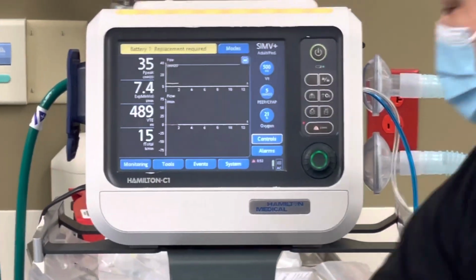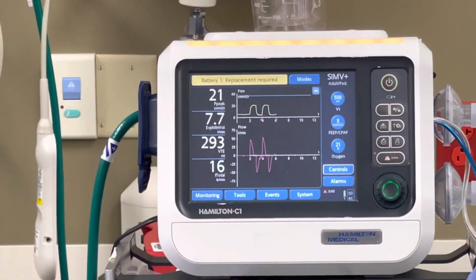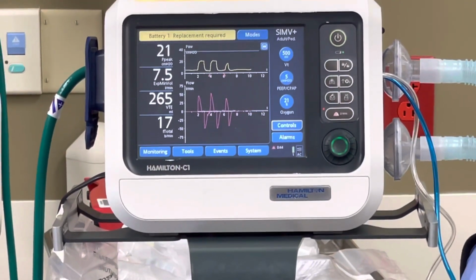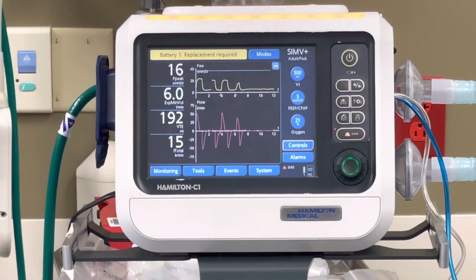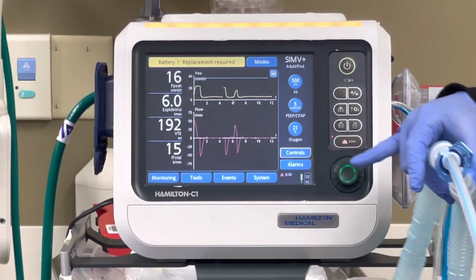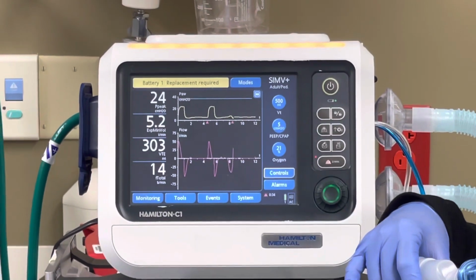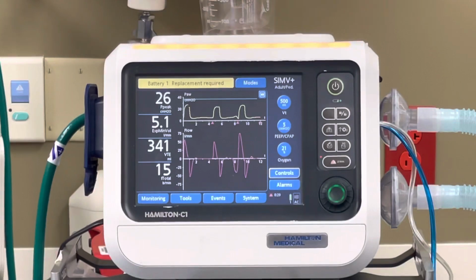The only difference here is, like I said, every breath that's the normal breath that's supposed to be delivered, all 12 breaths will be delivered at 500, but the spontaneous breaths are just going to get a little pressure support, so those volumes will change. You may see most of your breaths being around 480, 500, and then all of a sudden you'll see a few around 300. That's your patient taking their own individual breath.